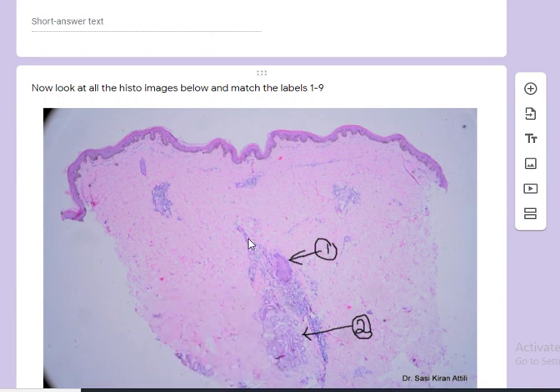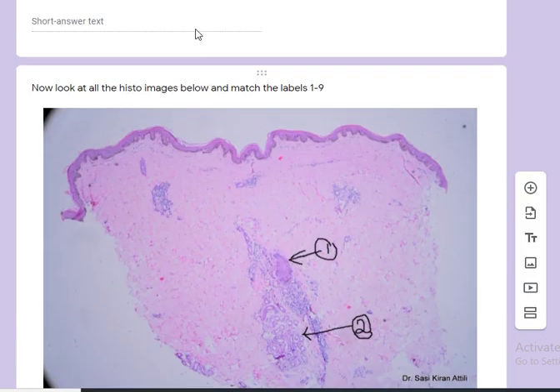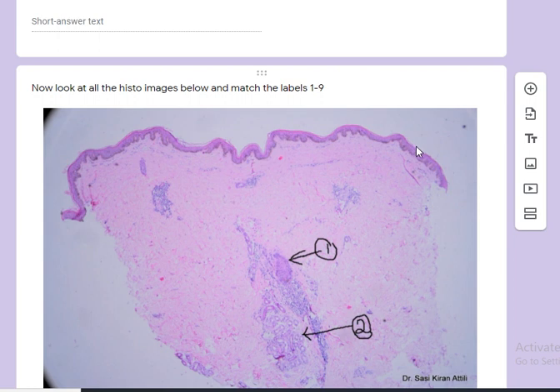So looking at the low power, you can even at low power make out this basal hypermelanosis. You can make it out here, the slight basal hypermelanosis. What you can also see is that comparatively the epidermis looks a bit atrophic. Here is what I would describe as effacement of the rete ridge pattern. So here the usual rete ridge pattern which is here is absent here.